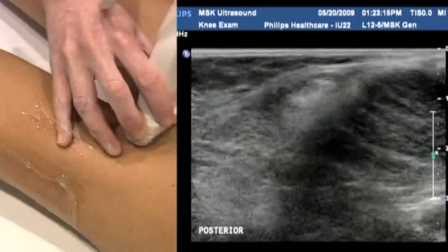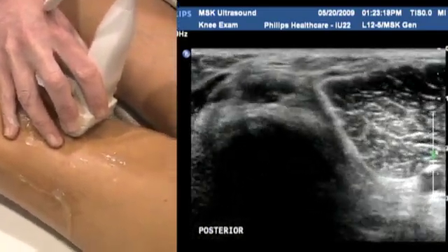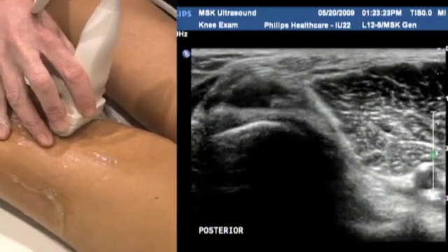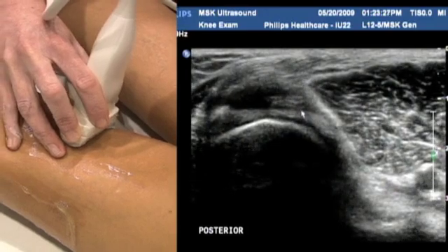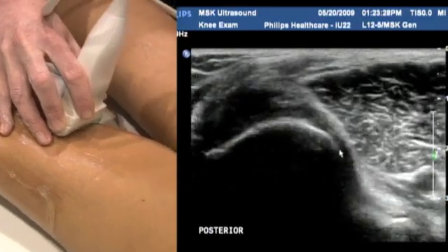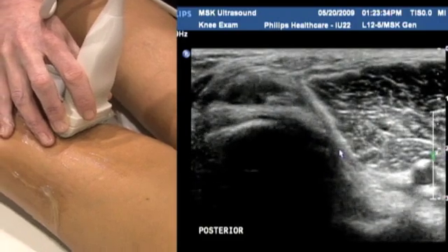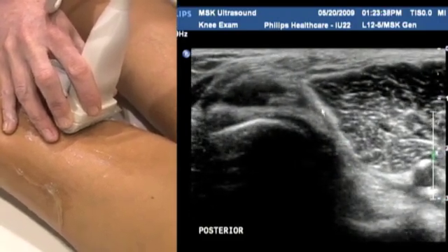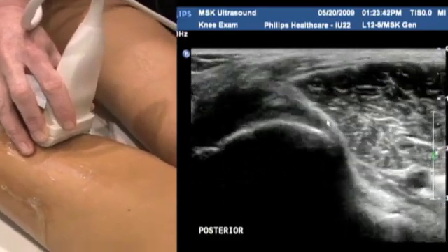So again, a Baker's cyst is going to appear medially in the popliteal fossa. It's going to lie between the semimembranosus and the medial gastroc muscles at the back here. So between these two guys. Our patient here doesn't have a Baker's cyst, which is a good thing, but you can see it would rise from this portion of the popliteal fossa and surround the medial gastroc muscle distally.